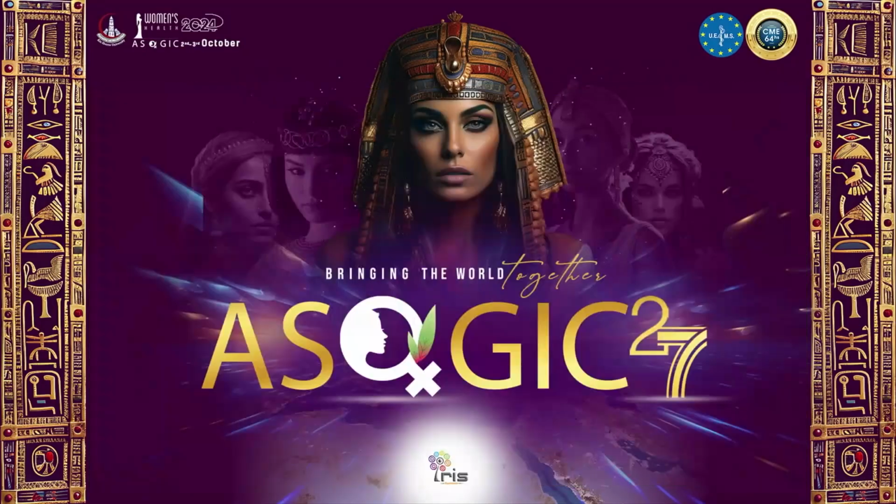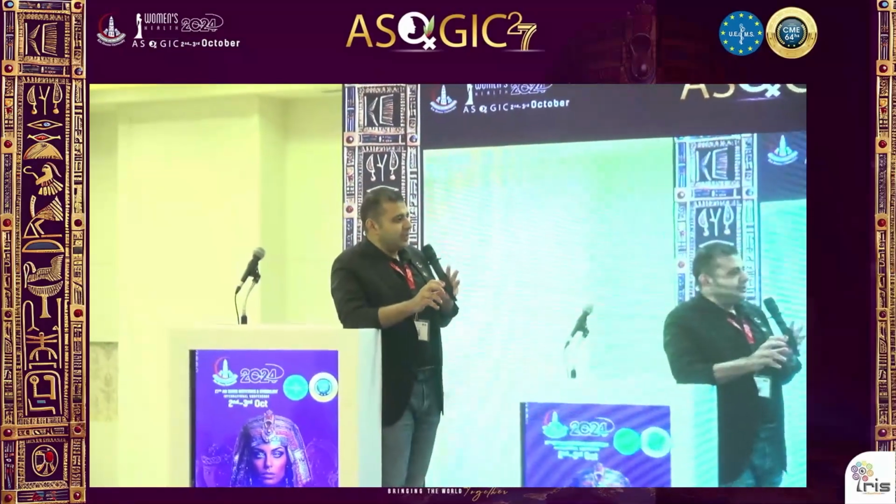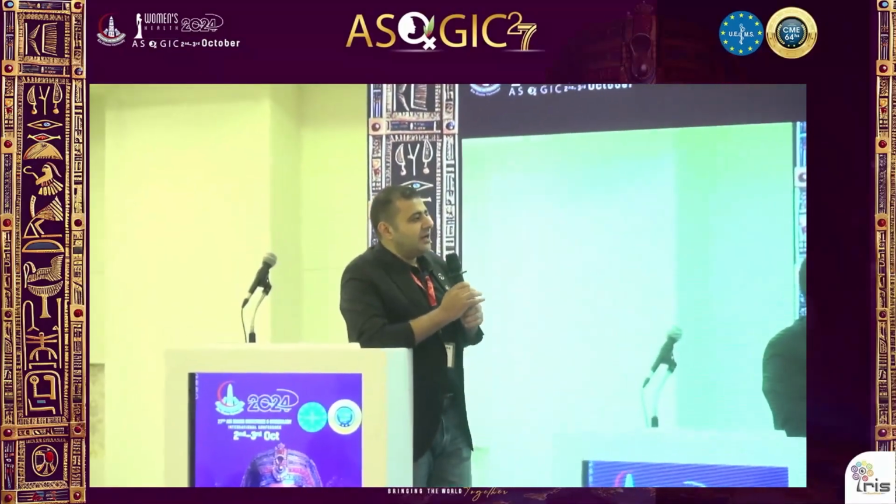Thank you, I like the questions. The first one, we don't have a reference which tells you what is safe or what's not safe, because this is a recently new technique to approach FIGO 3 myomas, and there aren't a lot of studies about the outcome. But there is a consensus among hysteroscopic surgeons that for FIGO 3, you operate up to 4 centimeter, which is very big, with residual myometrium behind the myoma more than 5 millimeter.